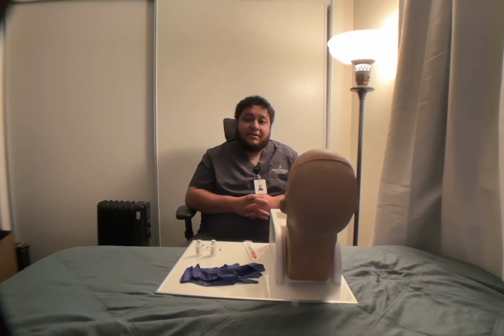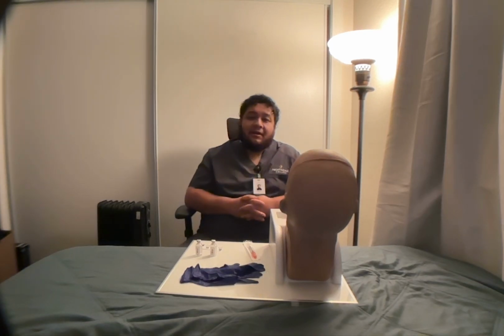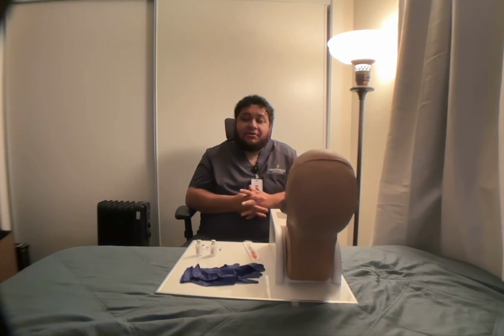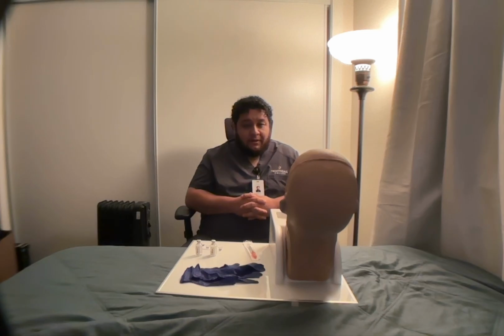Once I verify all 6 rights of medication administration, I'm going to proceed and check the medication in the EHR, and then verify the MAR. To verify the MAR, the doctor has ordered 4 units of regular insulin and 8 units of NPH insulin. That's a total of 12 units subcutaneously.